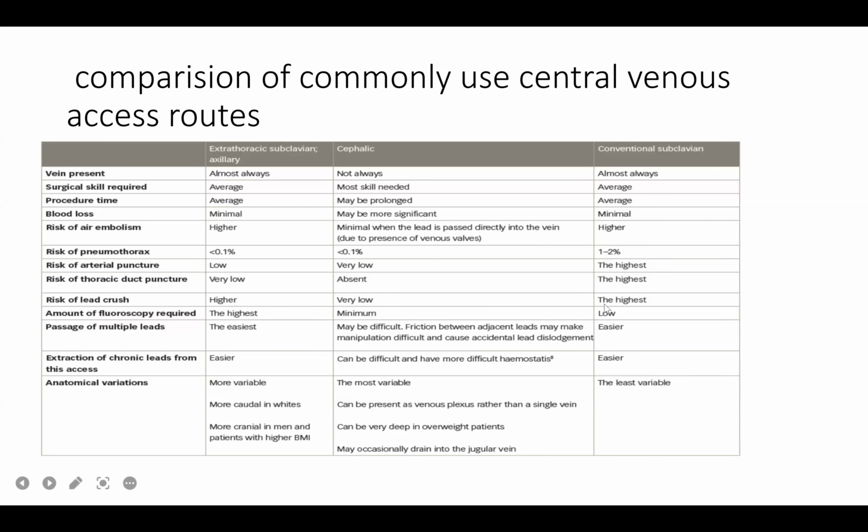While you're on the subject of arterial access, do you have any suggestions about looking at the fluoroscopy to see if you're arterial, as far as not taking the SVC route? And then just from what I've heard in the field, I haven't actually personally experienced this, but if you do have arterial access and you put a guide sheath in, don't panic, don't pull the guide sheath out until you have support from closure or somebody else who can help you. Yeah, from the surgeon, correct. Exactly, because if you pull that guide out, it's almost impossible to hold pressure and the patient can bleed out, which I've heard of happening.